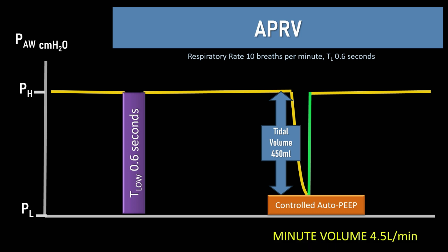Unfortunately, given the lung disease necessary to require this mode, much of this ventilation will be wasted and hypercapnia is to be expected. We call this permissive hypercapnia, and there's nothing much you can do about it, and frankly, it's not terribly harmful.